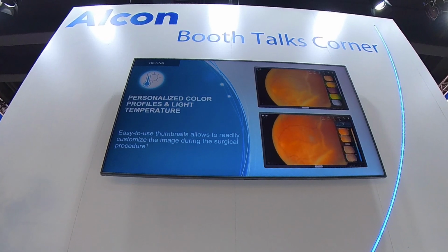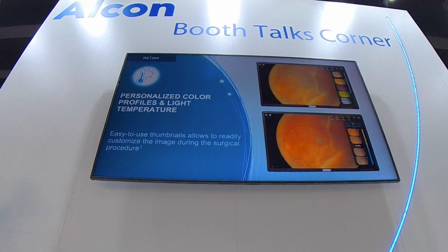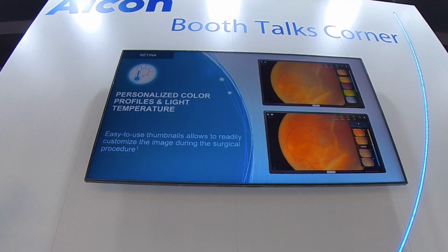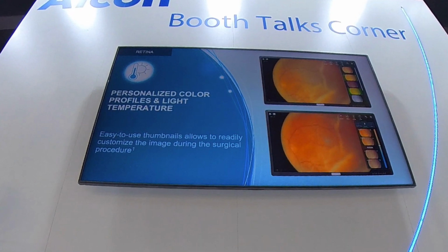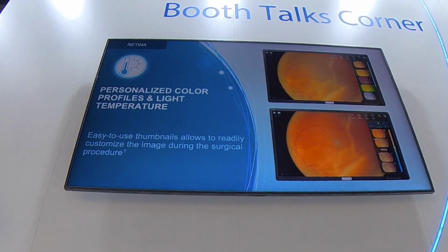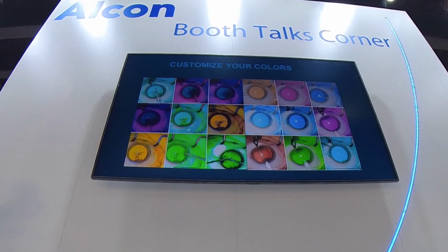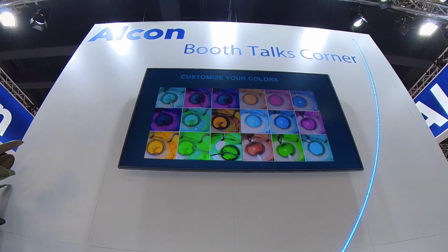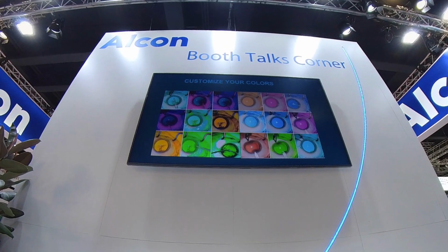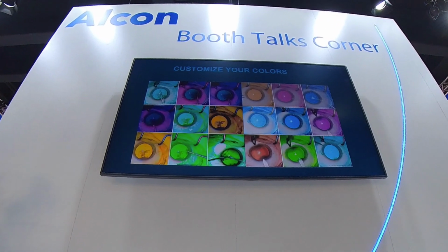In software version 1.431, there is an integrated palette of filters which are useful in different surgical situations, and it's really good to have it and to try them. I took this a little bit further, and I created my personal filter profiles a year ago. You can do whatever you want with the image, and you might be amazed at what can be achieved.